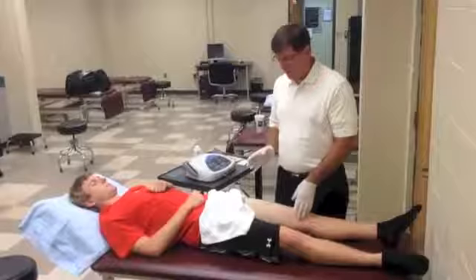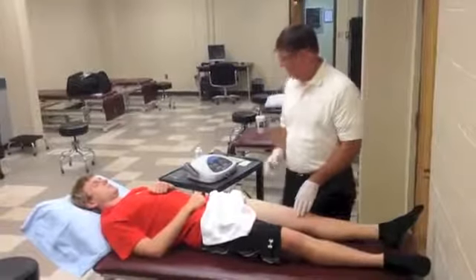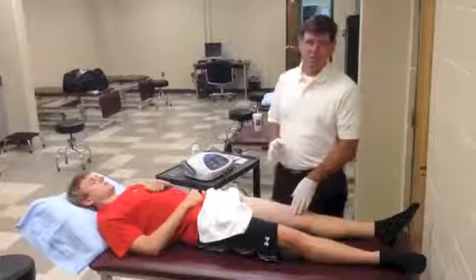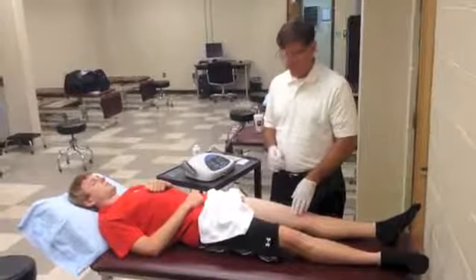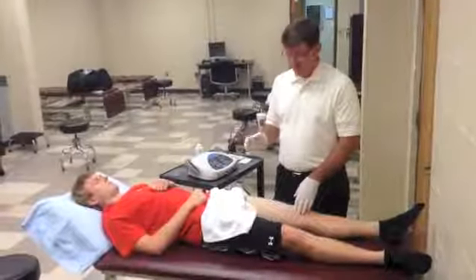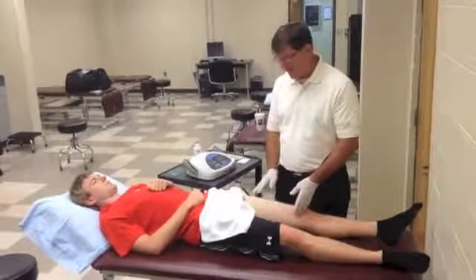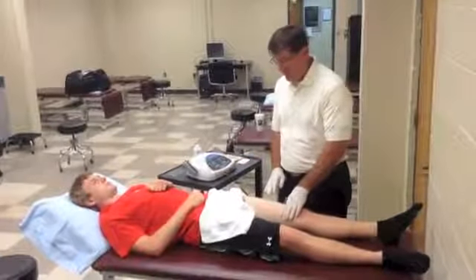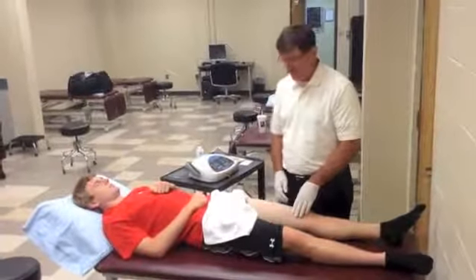I wanted to demonstrate a treatment for you today using deep tissue oscillation. This is a technique that's really quite good for a number of musculoskeletal applications, from acute to chronic situations. Our patient today has a subacute quadriceps strain. It's got a little bit of puffiness and certainly some tenderness in the quadricep.